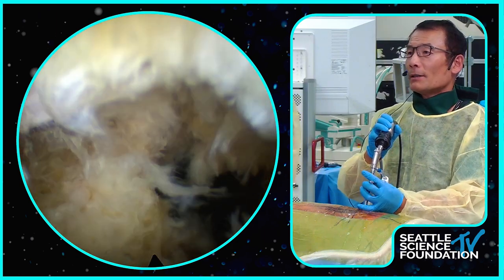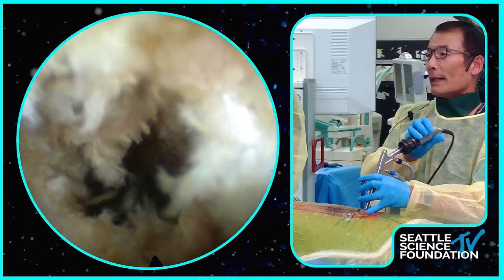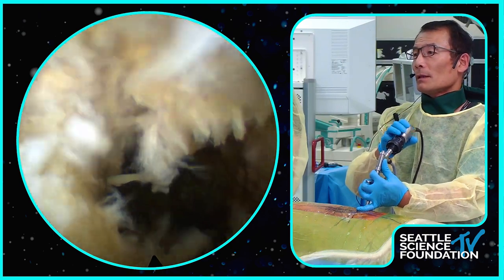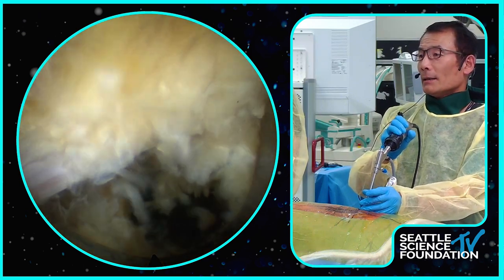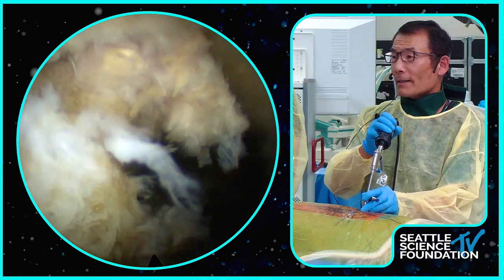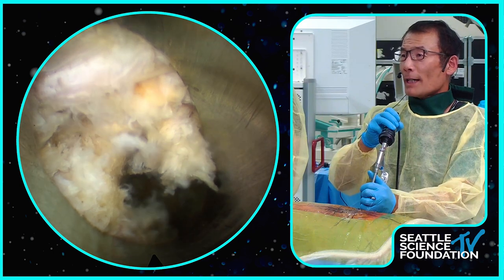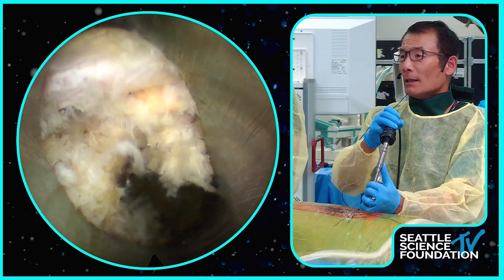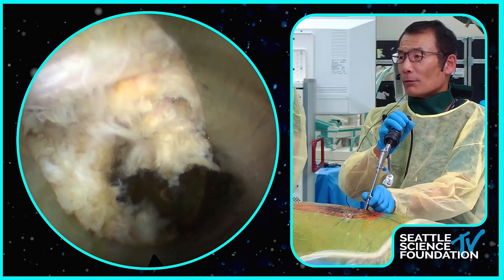So here, you see that? That's your L5. We're doing the L4-5 level. So that's your L5 nerve root. The L4 is over there. Under direct visualization, you can manipulate the cannula into the disk space sometimes. This way, I'm doing minimal retraction to my nerve root while doing the discectomy. It's in the view, but it's not being retracted. My goal is to minimize any nerve root retraction.